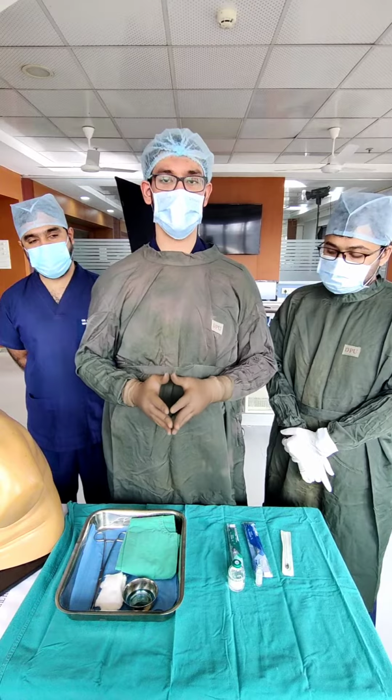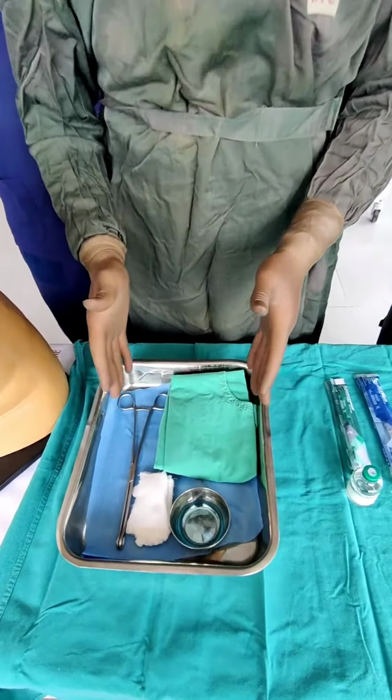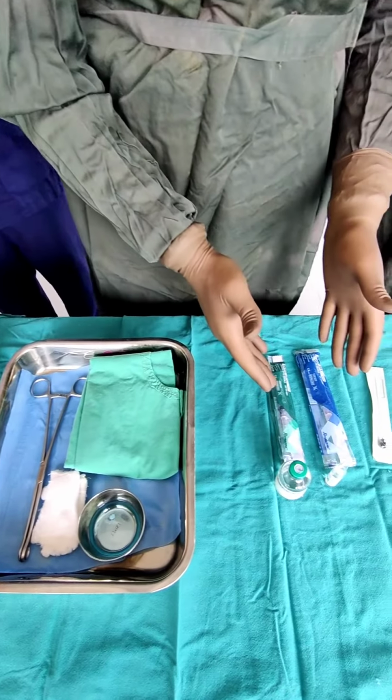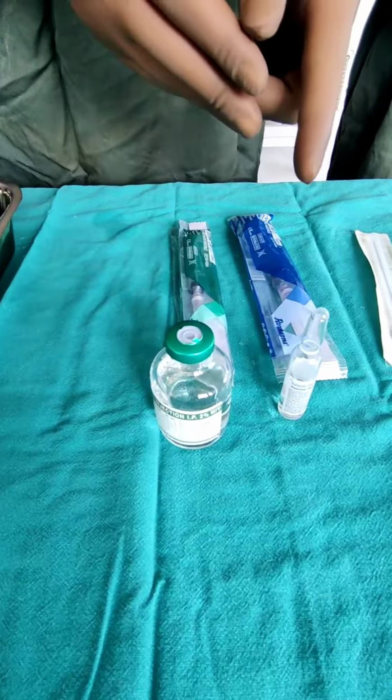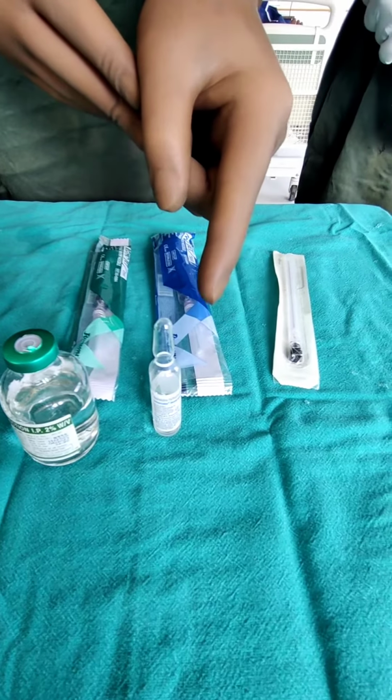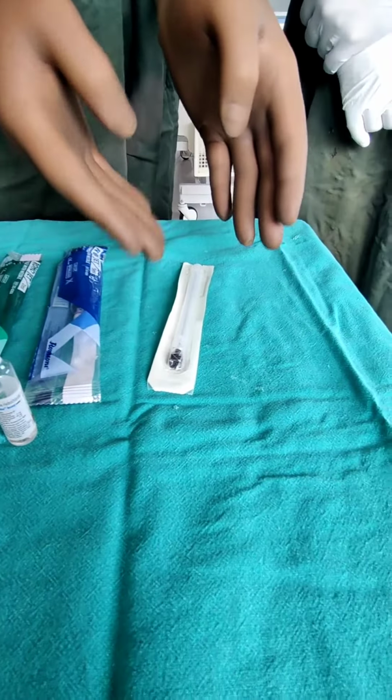To perform a subarachnoid block, there are basic requirements such as a sterile spinal tray. We require 2 syringes, one for local infiltration and one for performing the spinal anesthesia. Here we are using 0.5% bupivacaine heavy for the subarachnoid block, and we require a spinal needle as well.